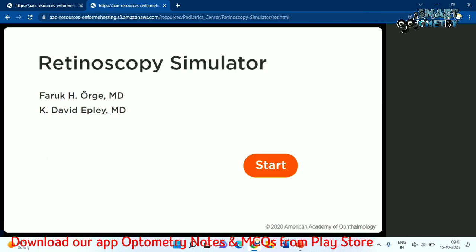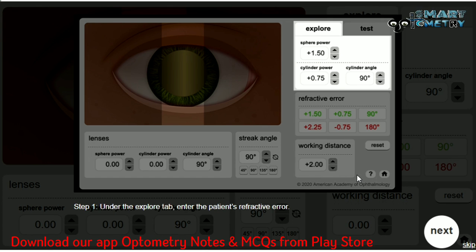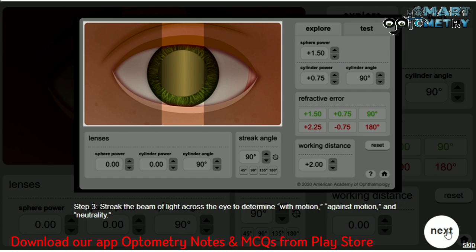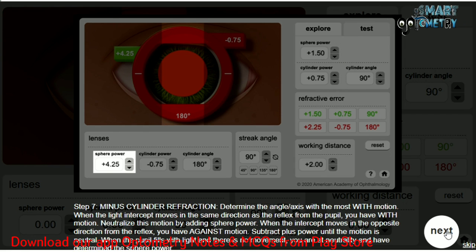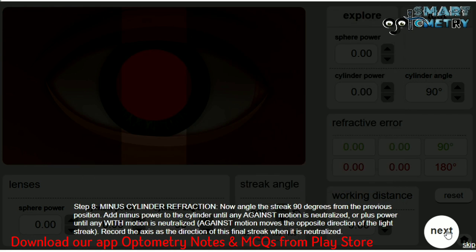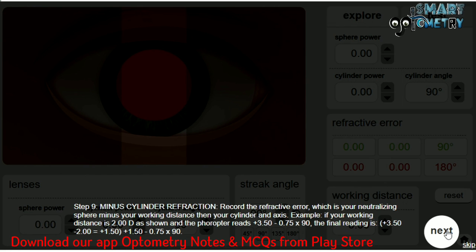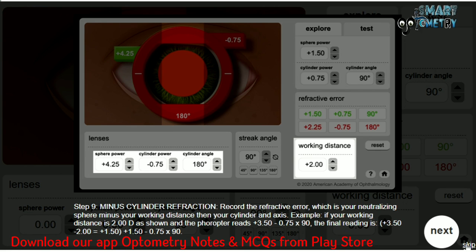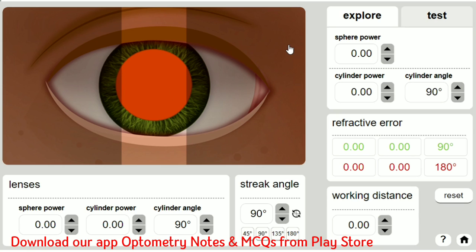After opening the website, click on 'Launch Retinoscopy Simulator', then click on 'Start'. After clicking start, the simulator will open and guide you on how to use it. You can skip all of this and directly move into practice mode.